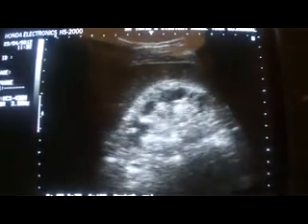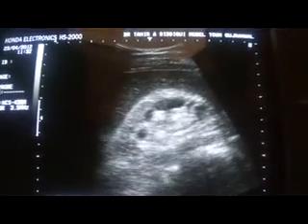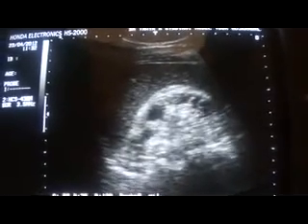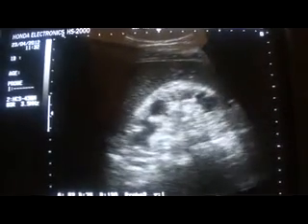So this is kidney post-op, showing parenchymal changes, muffled central sinus echo complex, significantly dilated renal pyramids in all regions. These are pyramids, these are pyramids, this is a pyramid. So this is a study of globally increased cortical echogenicity, prominent pyramids with loss of central sinus echo complex.